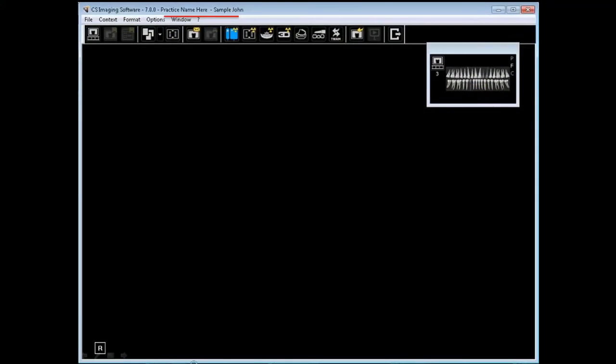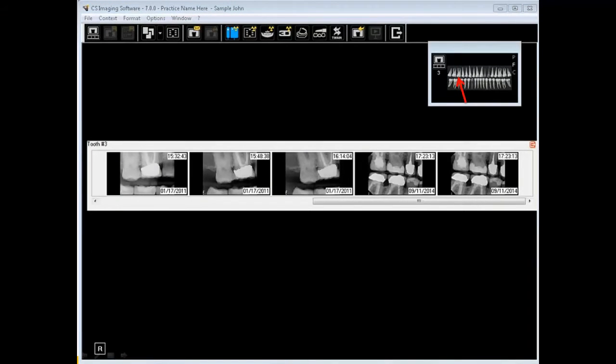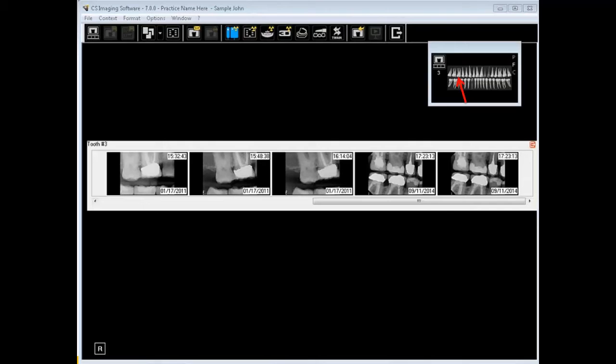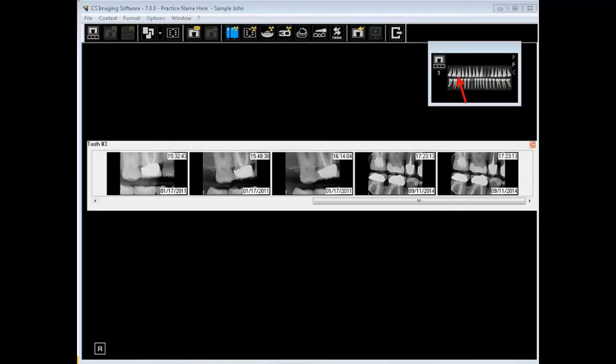The Dental Arch filter is automatically displayed when the imaging software is open. Click a highlighted tooth in the Dental Arch filter. A highlighted tooth indicates that there are images associated with that tooth. To open a single image or multiple images from the tooth associated with those images, select one image or multiple images and double left-click the last image.